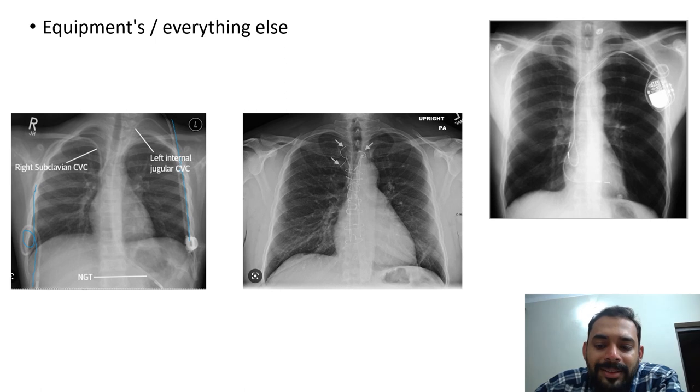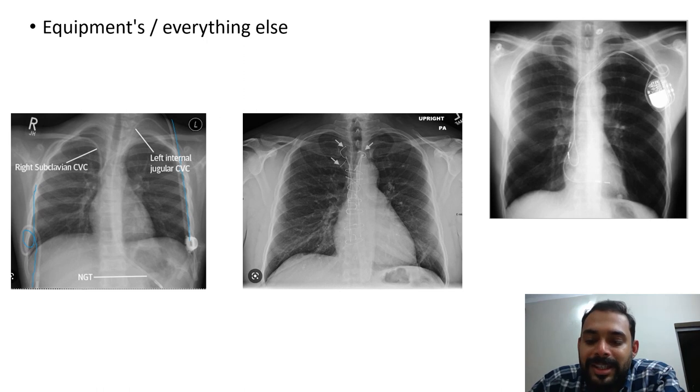So these are the basic things that you have to look at while you read and try to interpret X-rays. Patient identification is important. Always correlate clinically. You examine the patient first, you have your differentials, then you see the X-ray and see whether they are actually fitting in. The mnemonic that makes it easy is A, B, C, D, E, where A is for airway, B is for breathing, that is, you look at the lung field, and also for bony abnormalities and the bony cage. Then C for the cardiac size, D for the diaphragm, and E for equipment and everything else. Thank you.